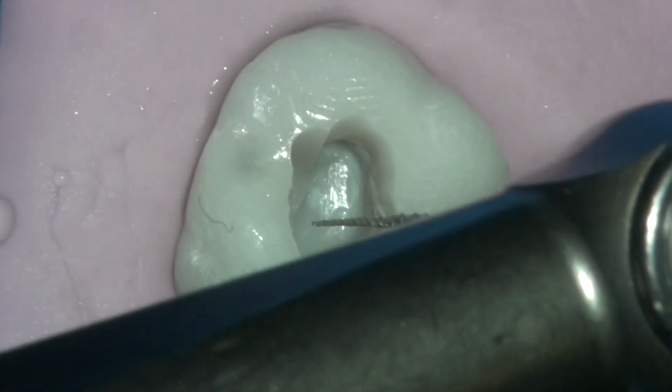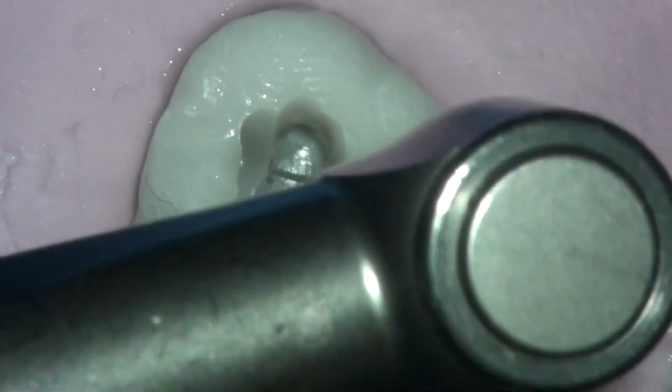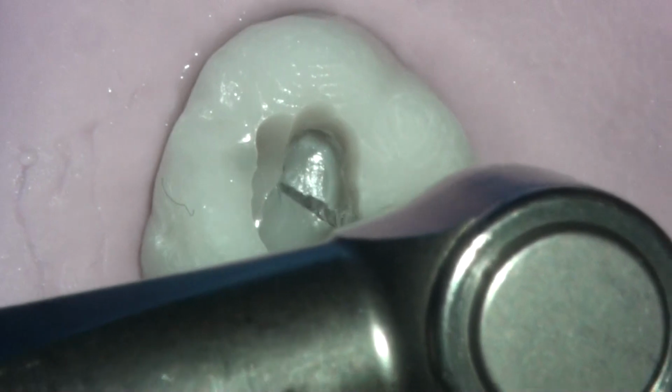And we will only essentially introduce this into the point of resistance. And this canal obviously is more difficult than doing a less calcified or less tortuous canal. So we introduce our file in, and we brush on the outstroke.